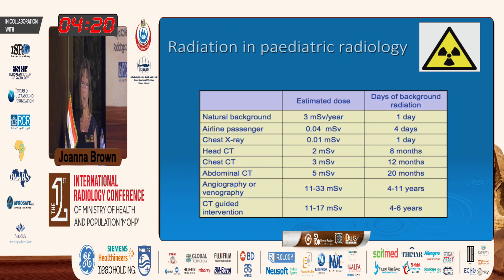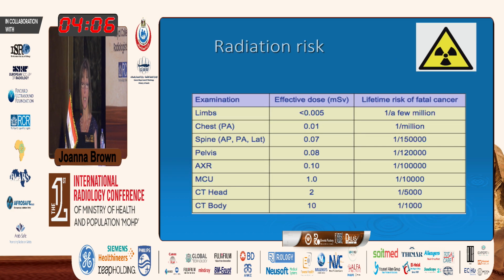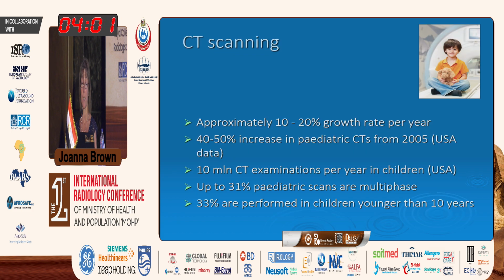And then the estimated dose of the examination, and you can see here how it increases from normal radiography to the cross-sectional images such as CT. And again, from the CT head and the body, with the millisieverts. And why am I showing you this?